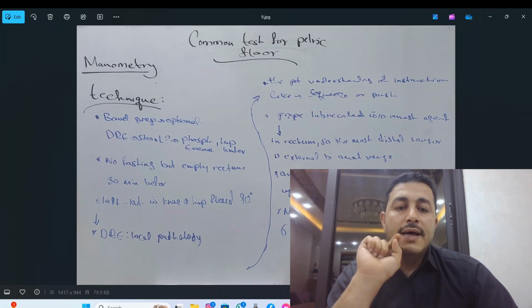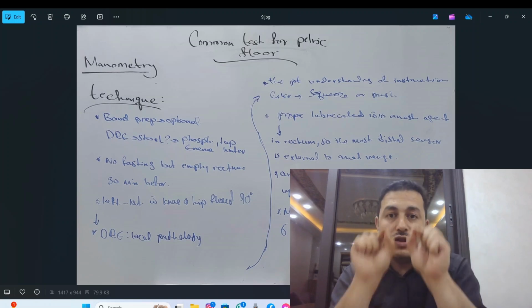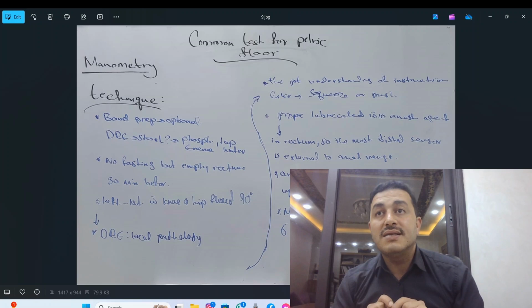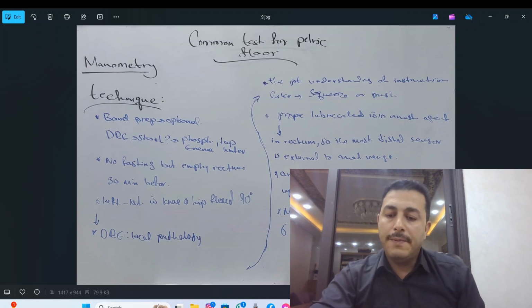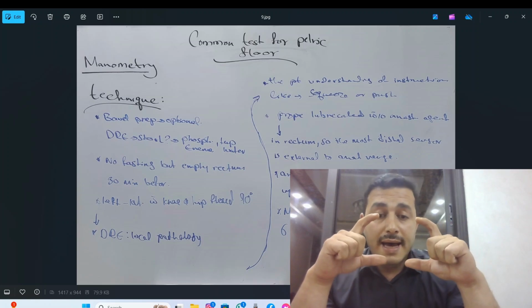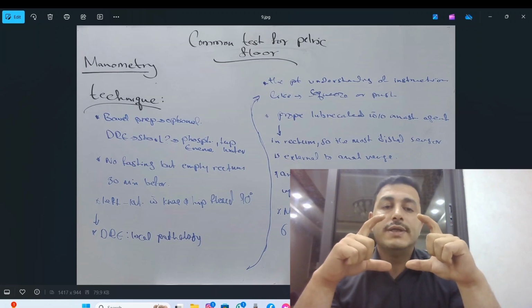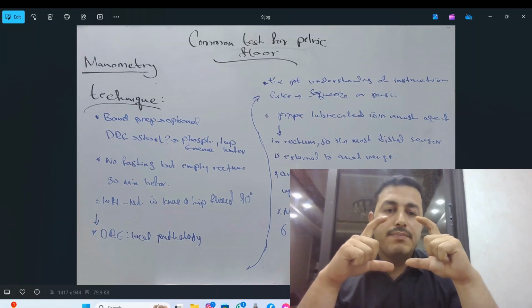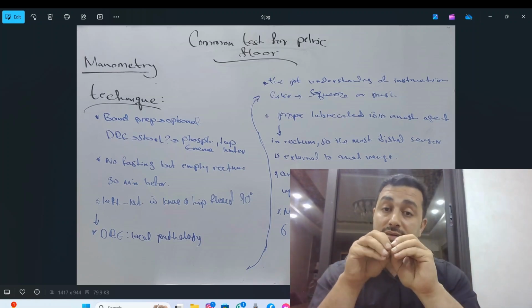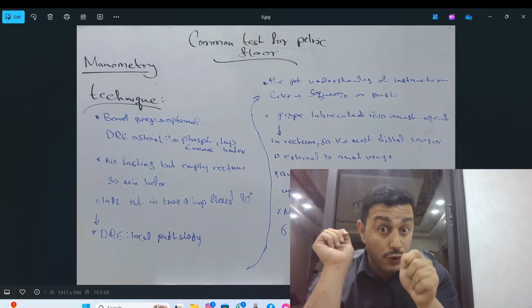What else we need? When we record the pressure, we need to record it along at least 6 centimeter. As we said, we talked about the anal length. We should measure pressure along at least 6 centimeter, and this can be done with the pull-through technique.